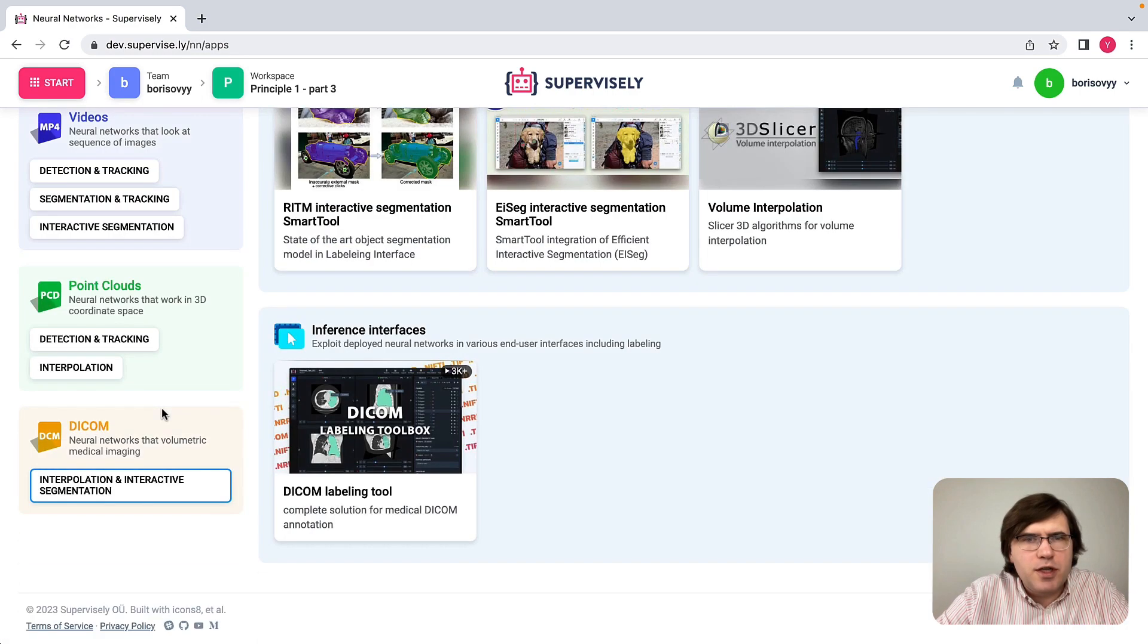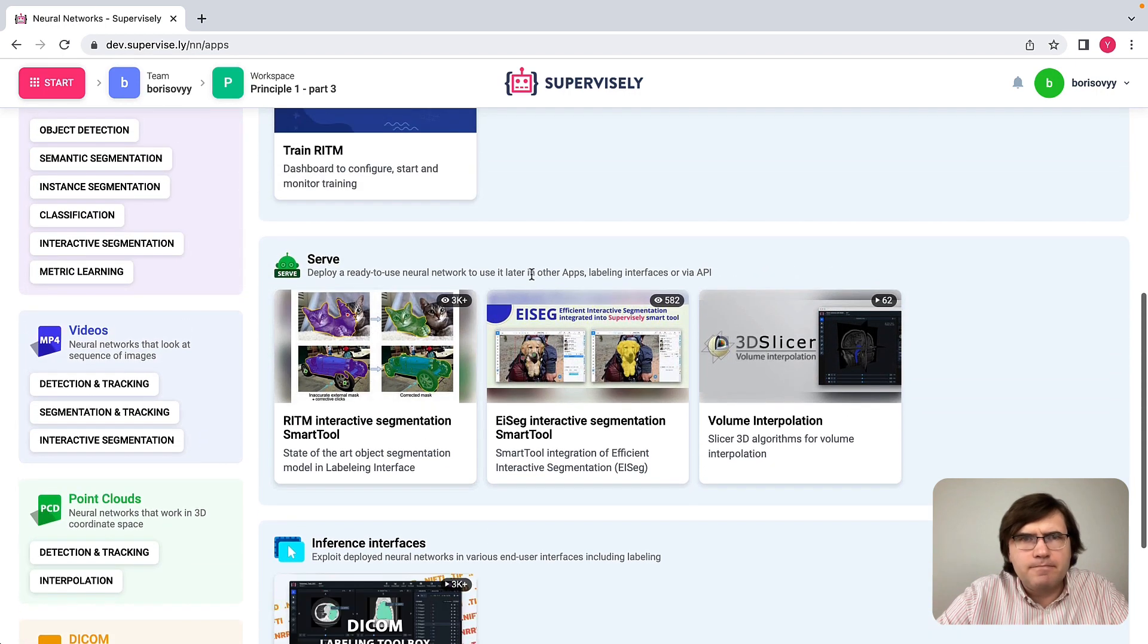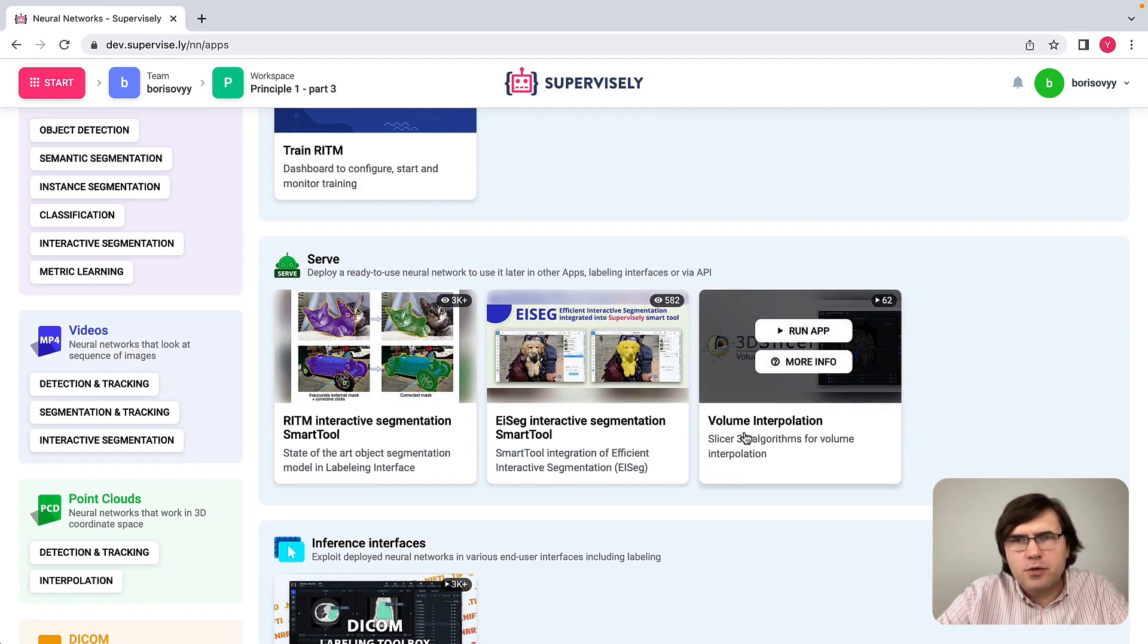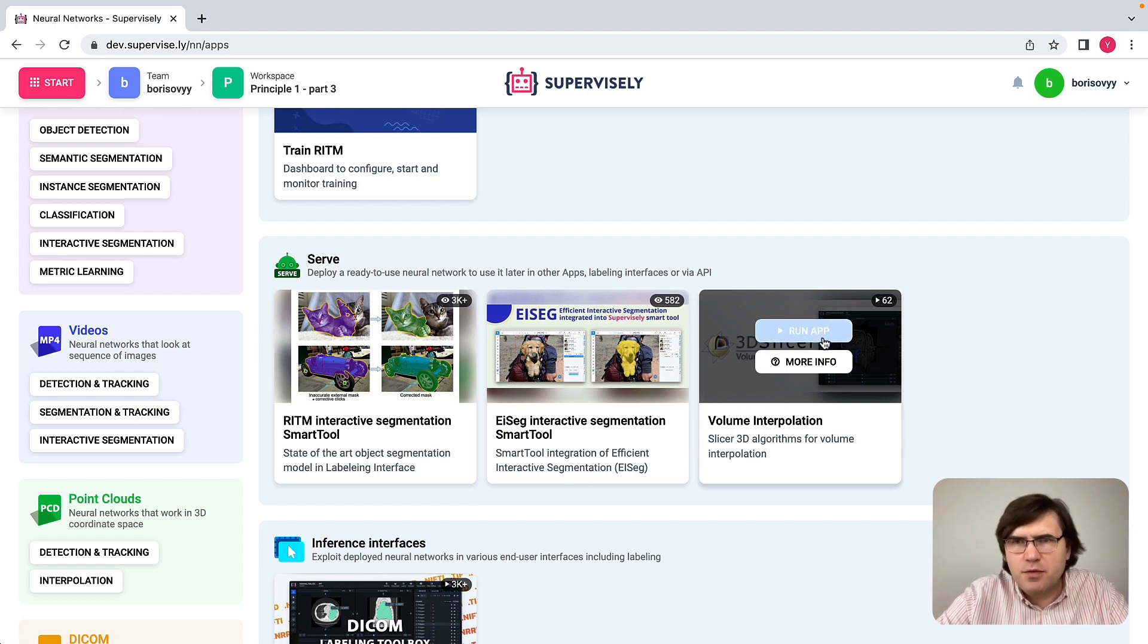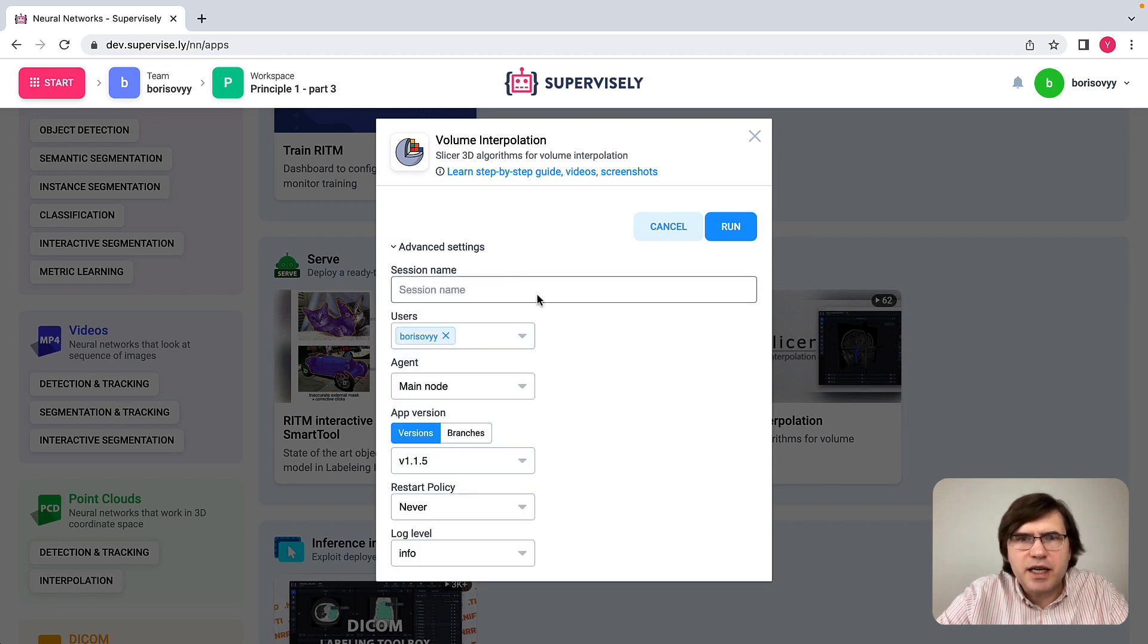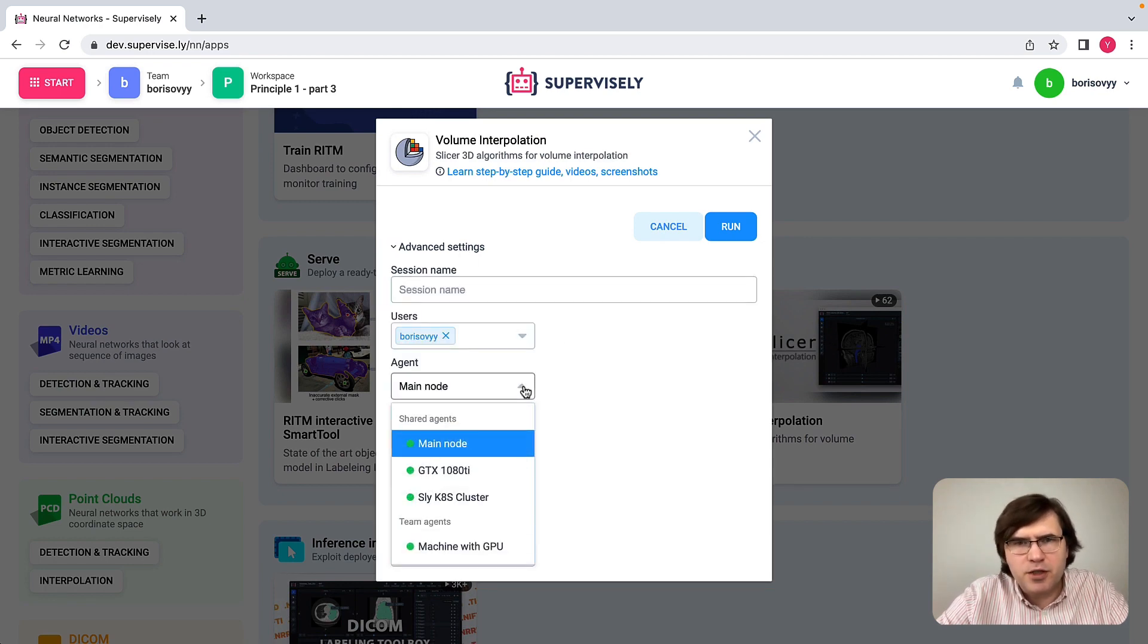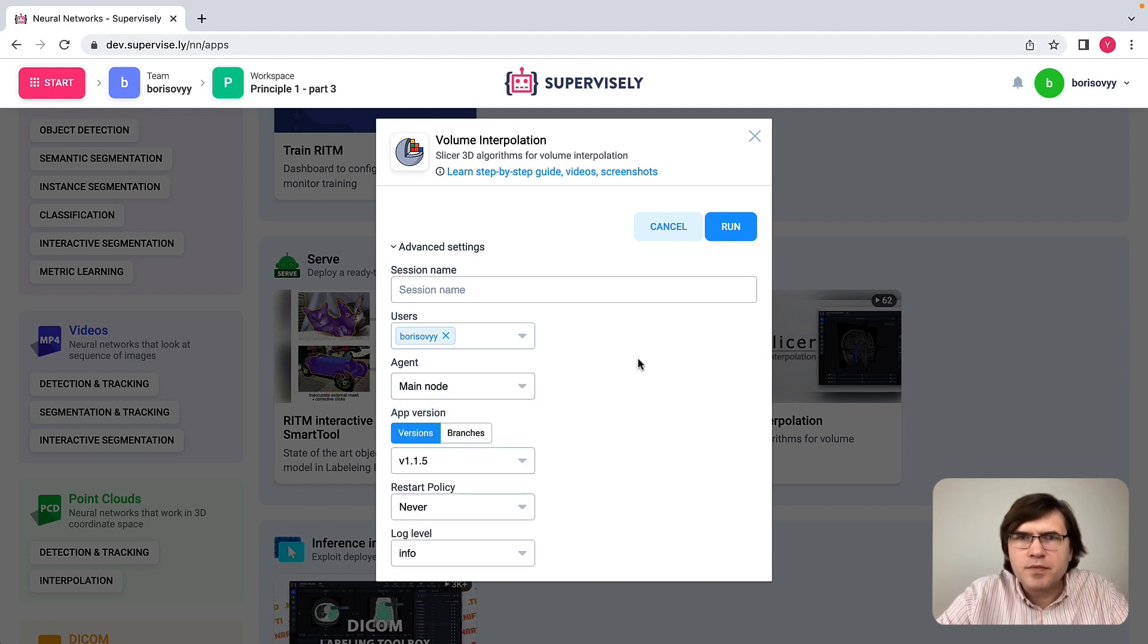What I would like to show is how we can use the interpolation app. There is a volume interpolation app available here which I will just run. This app doesn't require GPU, so I will run it on the main node, the machine that does not have GPU installed. So let me run this one.